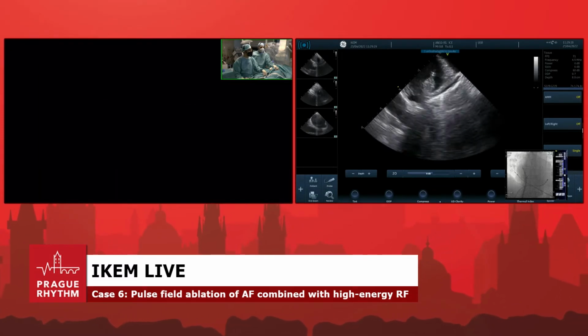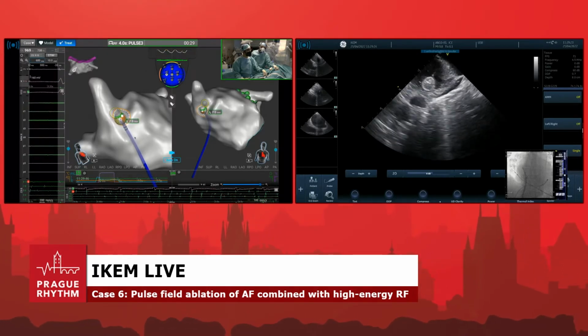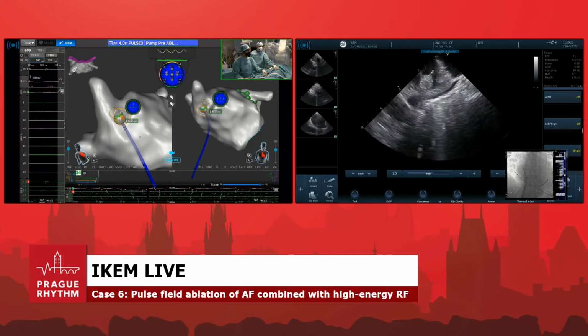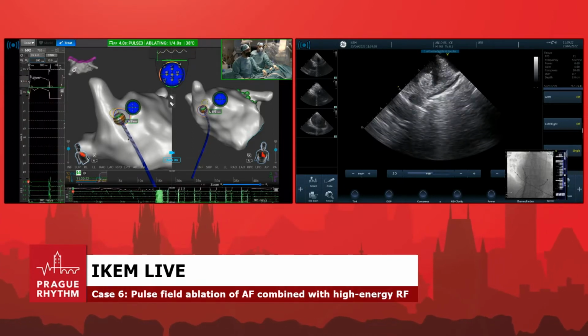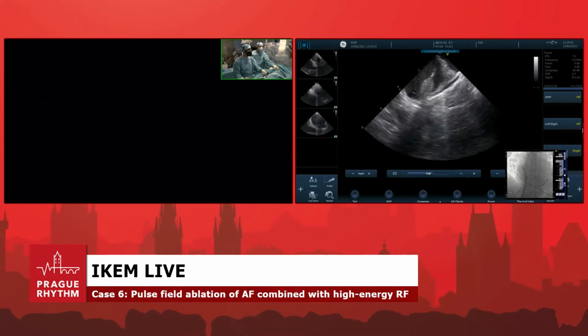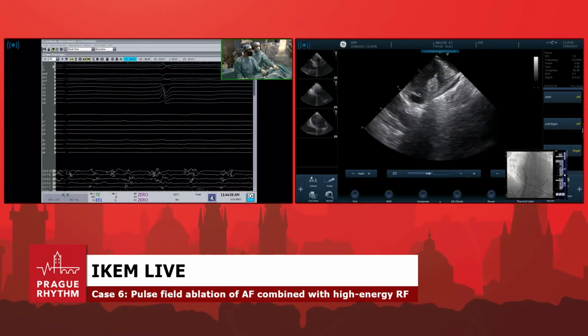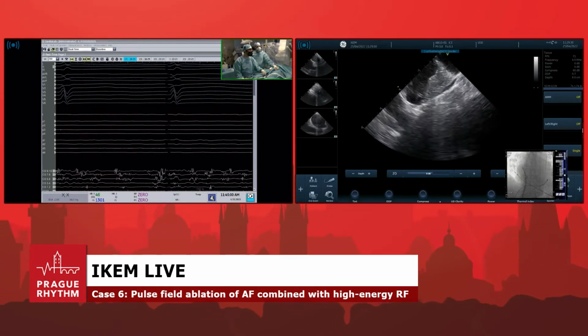Just to give you the idea. You see signals here as well, so you see small movement, and there are still no signals. Can we give atropine now? We have a little bit of pauses. It's very instructive as we have pauses. I don't know. Let's see.